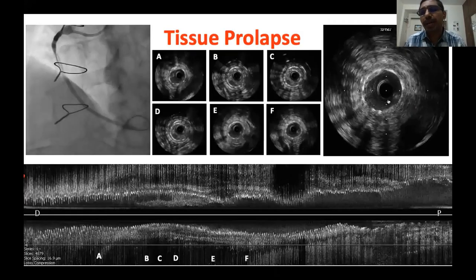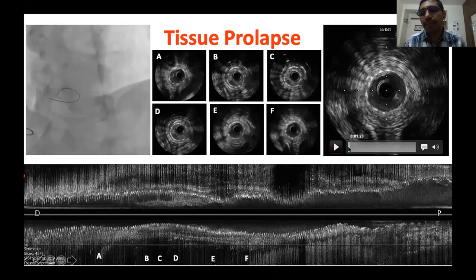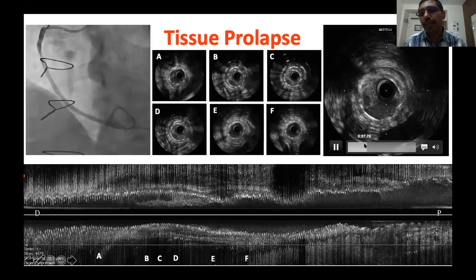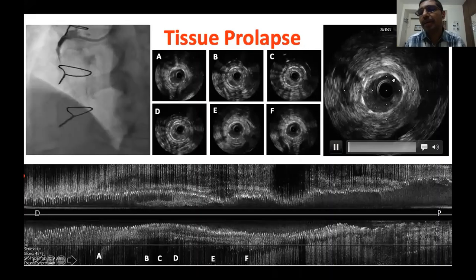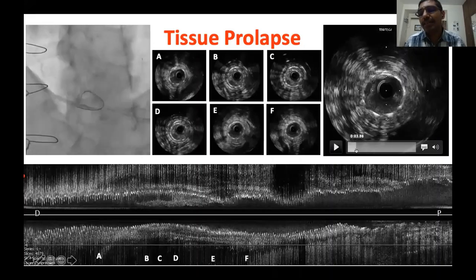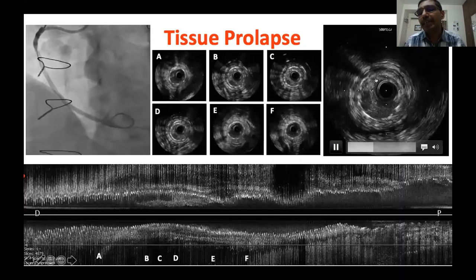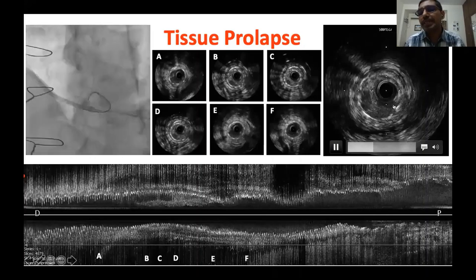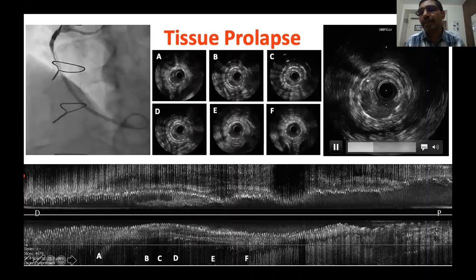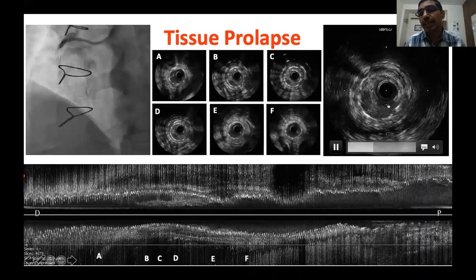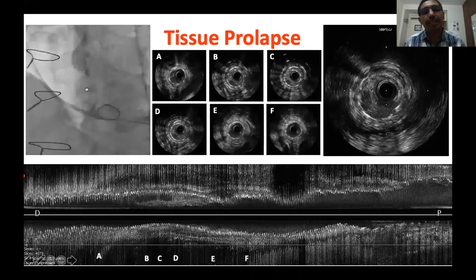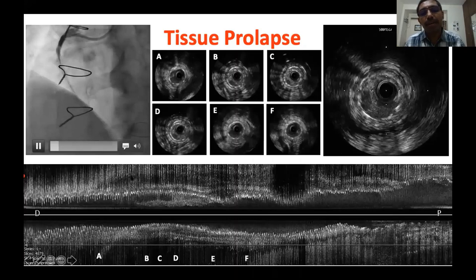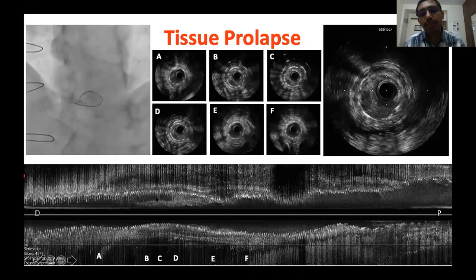Tissue prolapse is the prolapse of atherothrombotic material into the stent — it contains either atherosclerotic material or thrombus. Here is the typical appearance of tissue prolapse: this is your stent and this is all the prolapsing material between the struts. In this case done in an SVG graft — angiographically showing how much it has narrowed — you can see the stent only with the ghost signal and all the remaining is prolapse tissue. The longitudinal view shows the extensive prolapse of atherothrombotic material inside the stent.